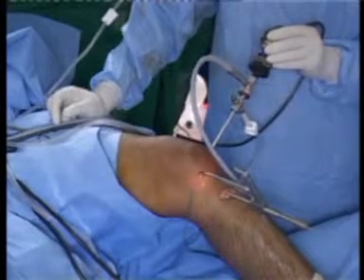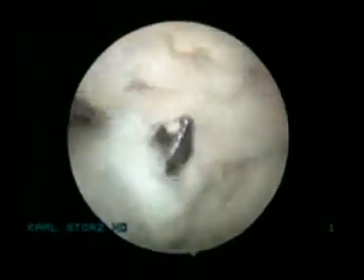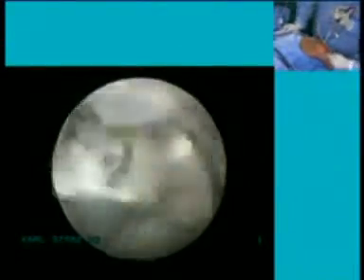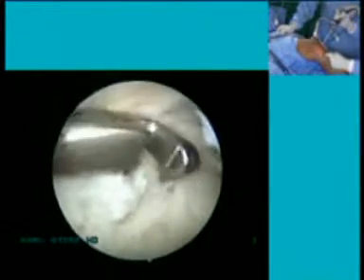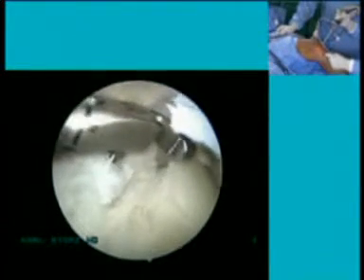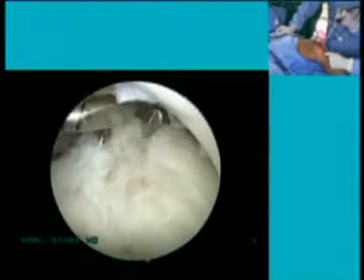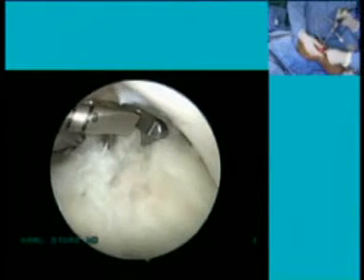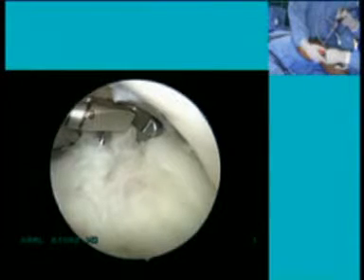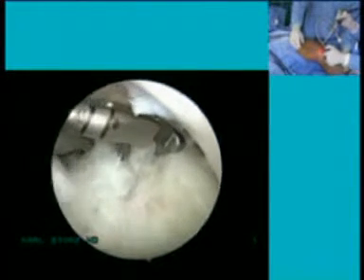Dr. Wolf, can you hear us? Yes. Great, so you're back live. Please proceed, and please show the tibial jig more anterior. Can you give me the guide, please? Okay, then we take the guide again, and we can measure the distance between the PL and AM insertion. Okay, drill. Dr. Vinod, are you happy with the AM guide wire? Well, I think it looks okay.